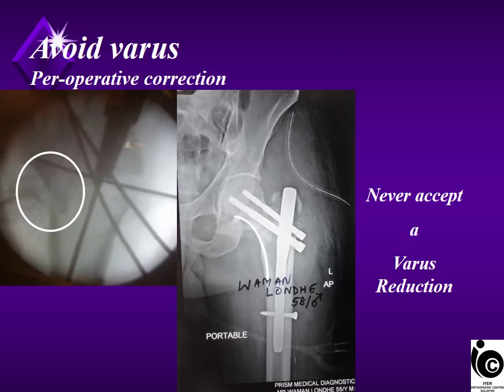Getting a stable reduction with the beak inside is only possible with a surface implant. If you are using an intramedullary implant, it's always varus. With a surface implant, you can achieve a good valgus as well as the beak can be inside. But in an intramedullary implant, the beak inside the distal medullary canal means it's in varus, it's an invitation for failure, or as Dr. Muki, my friend, calls it, it's a day one failure.